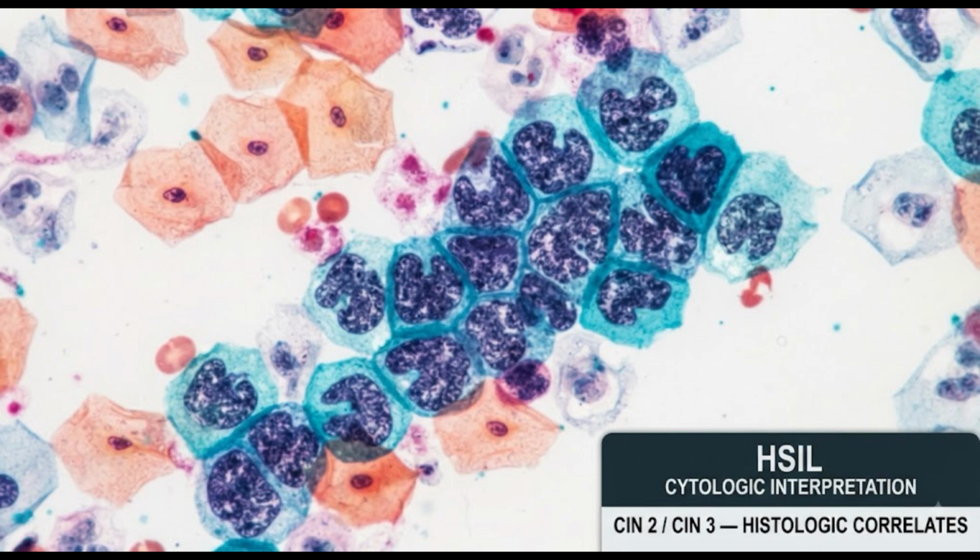HSIL in Cervical Cytology | Bethesda criteria, Morphology, Differential diagnosis and Pitfalls. What HSIL actually means. HSIL stands for high-grade squamous intraepithelial lesion.